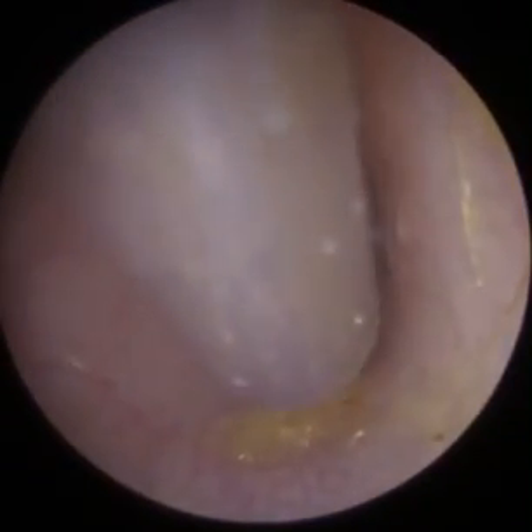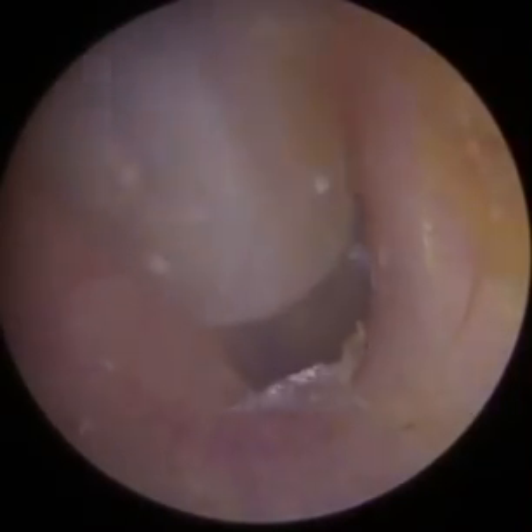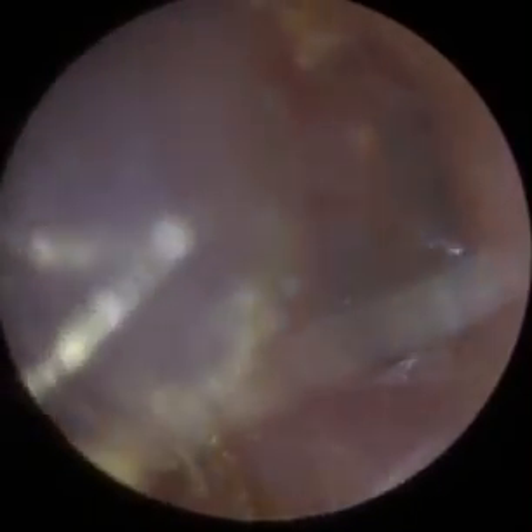Let's spin that hover over there, see if it comes out. Don't make any contact. Yeah, a bit noisy that, as you heard. A bit more wax hiding behind here.